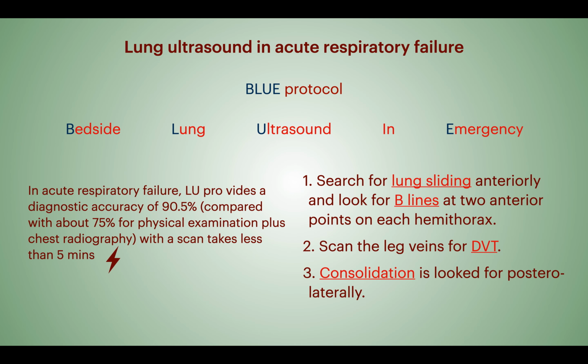So finally, if I am on call in the ICU and I get a patient with acute severe dyspnea and acute respiratory failure, how can I benefit from lung ultrasound? There is what's called the blue protocol. It stands for B for bedside, L for lung, U for ultrasound, E for emergency. So it's bedside lung ultrasound in emergency, the blue protocol.